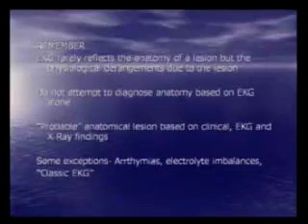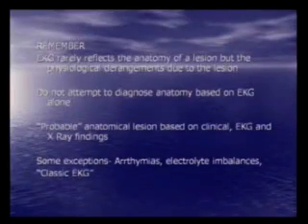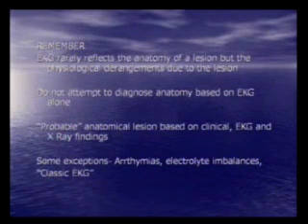Remember that ECG rarely reflects the anatomy of the lesion, but it reflects the physiological derangements due to the lesion. For example, if an ECG shows left ventricular hypertrophy, it shows the physiological problem. The cause can be anything. It can be aortic stenosis, it can be hypertension, it can be subaortic stenosis, it could be hypertrophic cardiomyopathy. So you cannot diagnose the anatomy by looking at the ECG, but you can predict the physiology by looking at the ECG.